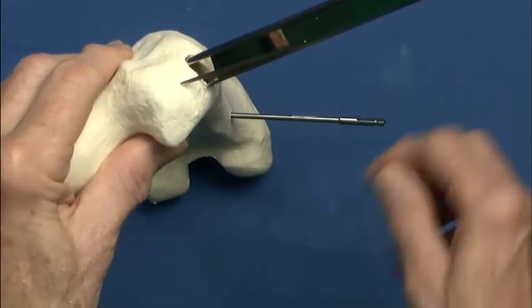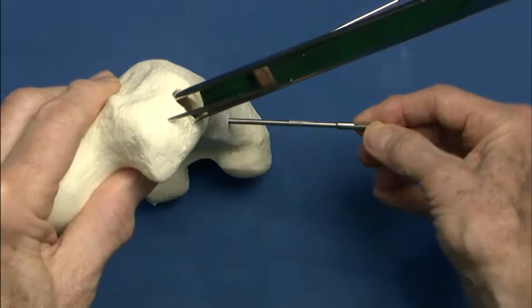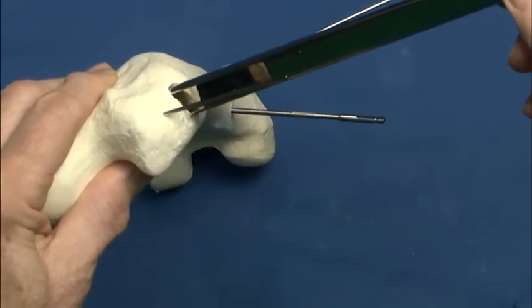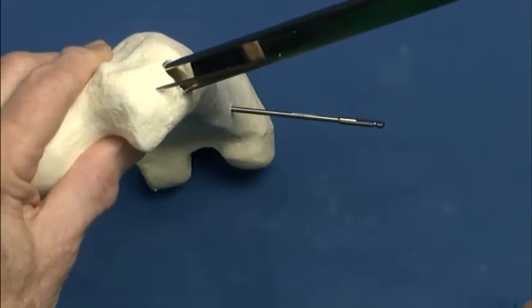So with the transverse osteotomy, we're going to cut and derotate so that these are going to then at some point be parallel, although you have to have very good control over the proximal component. And at that point, you can do your closing wedge from the distal segment.